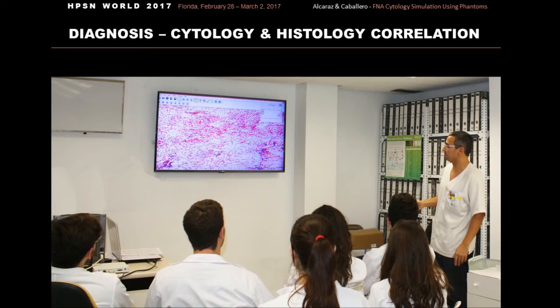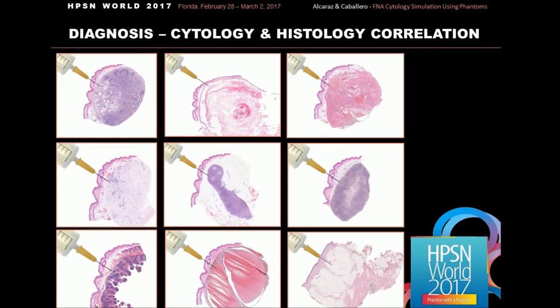Here we are in the room with an interactive explanation of the different cases. We can correlate the cytology, that is individual cells in the smears, with the whole sample in the biopsy, which means the whole lesion, for a better understanding of the disease.